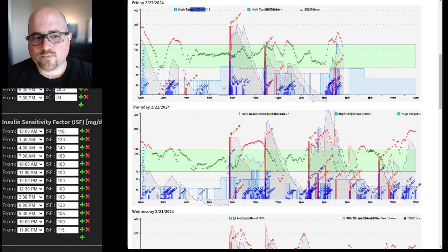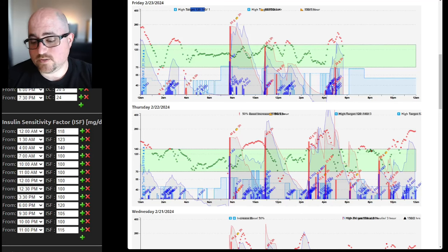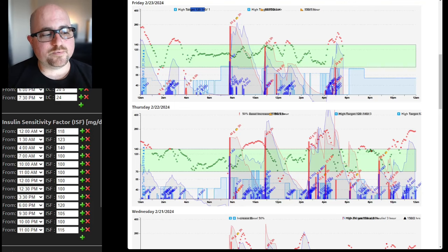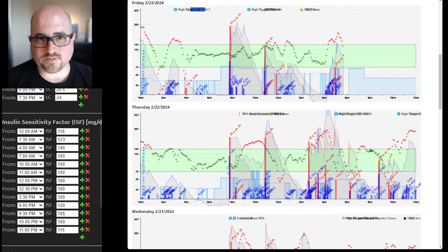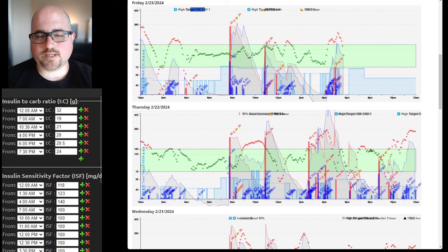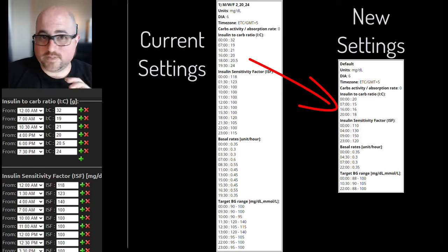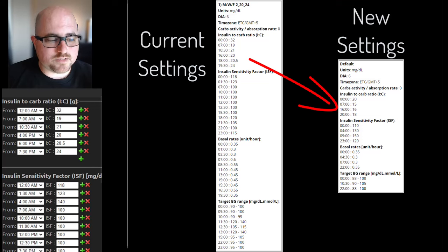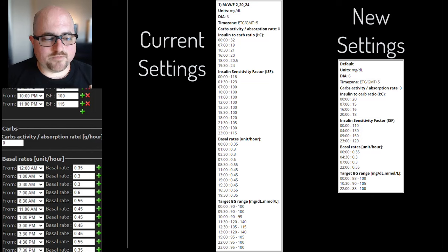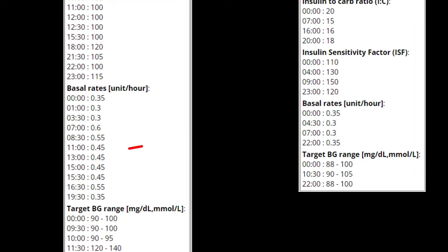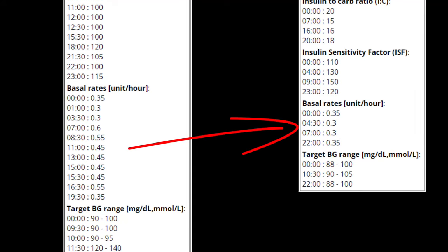You don't want waves so big that it's actually sending him low and you're having to treat and go back up. If you feel like things are running on the lower side, set a higher target like you did here — that way there's room for the numbers to move without causing you to wake up and deal with it. We want to try to get a pretty smooth number. If you're real adventurous, and today's Friday so you have the weekend — you don't have to worry about school — this is a better time for this. You could do a pretty radical change, which I would not advise most people to do unless they've done it a lot: change everything at once. I would start creeping your carb ratios down toward the 15, maybe even 12 mark. Move in that direction as you start to back off the basal.